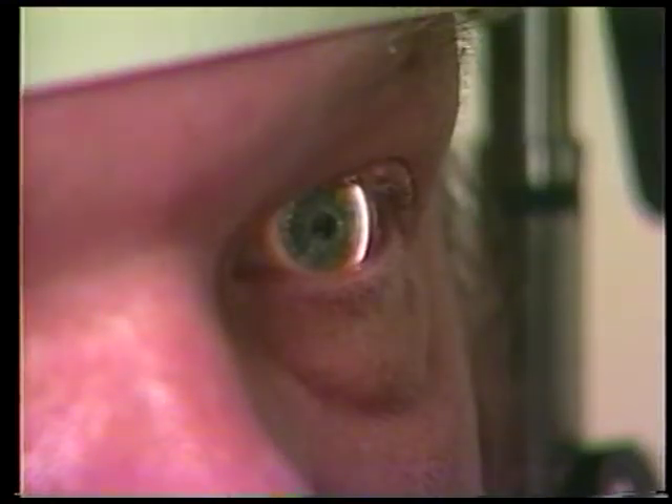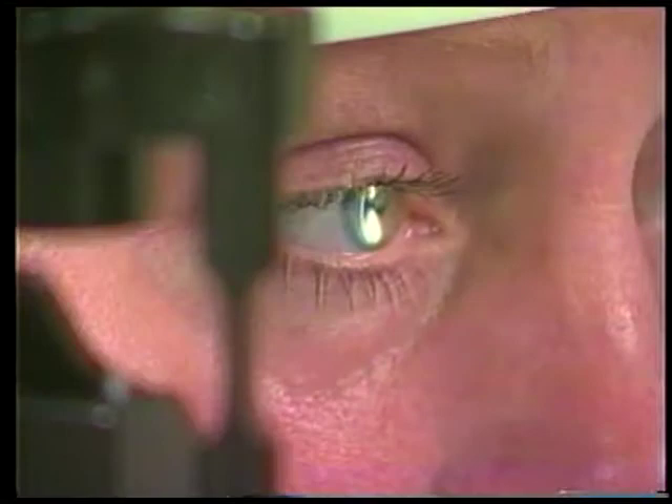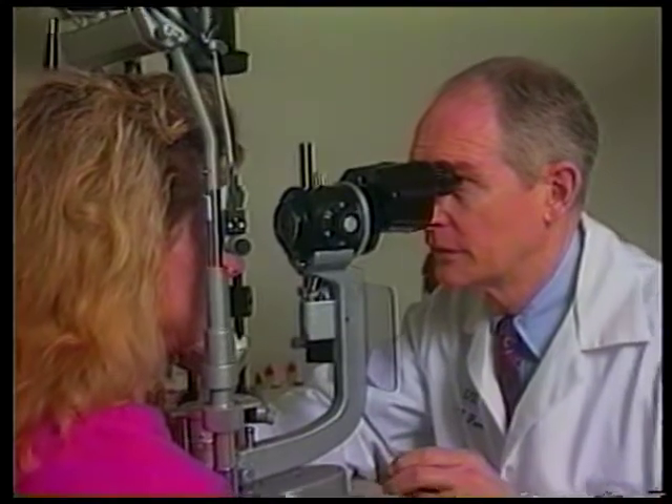In review, for most slit lamp exams you will use the power at five volts, no filters, 10x magnification, a narrow slit beam, and the slit illuminator swung from side to side at an angle of approximately 35 to 45 degrees from the microscope. It is the fine adjustments of the angle of the lamp arm and the joystick that reveal the subtle details. Slit lamp biomicroscopy is a dynamic exam.